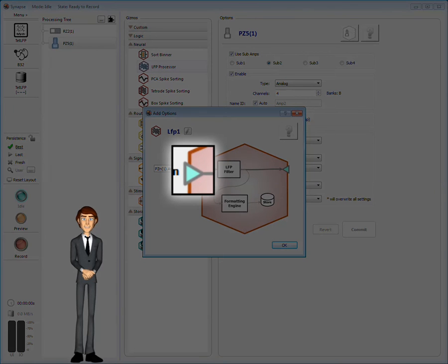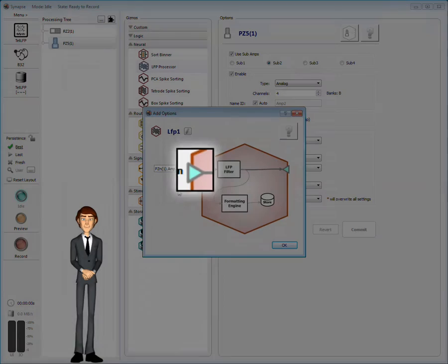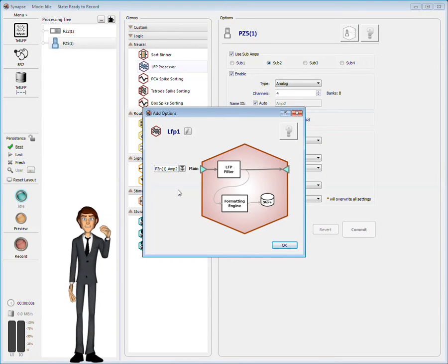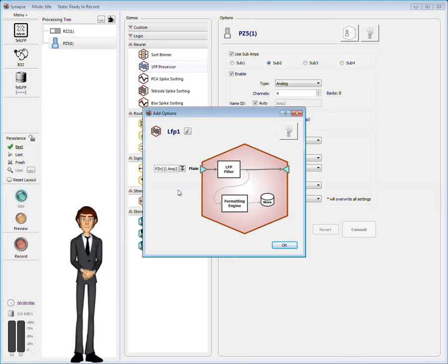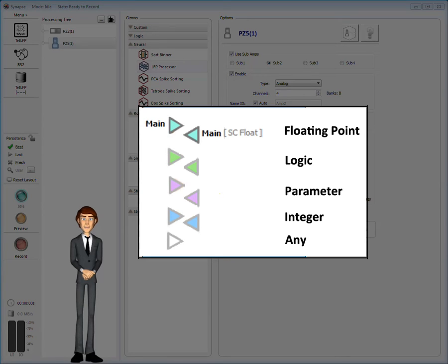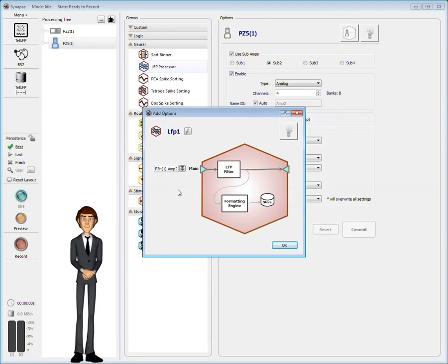This aqua icon means the gizmo expects a floating point input, which is exactly what the PZ5 provides. There are a number of data types, including green for logic signals, pink lavender for parameters, blue for integers, and white for inputs that can accept any data type.